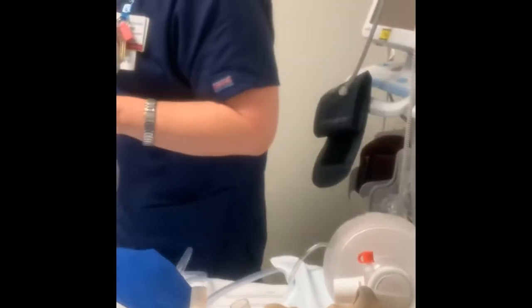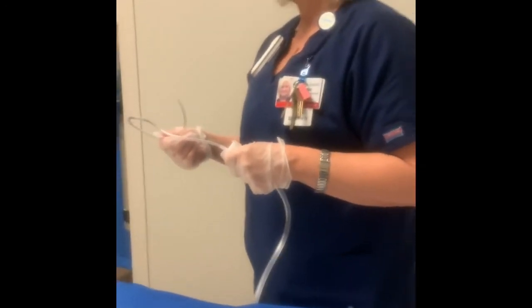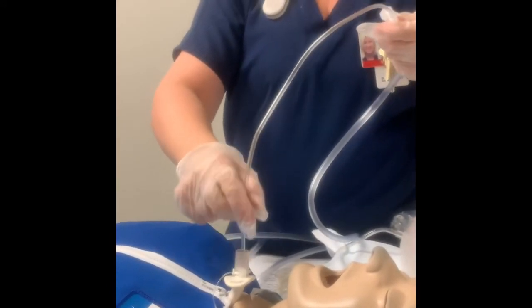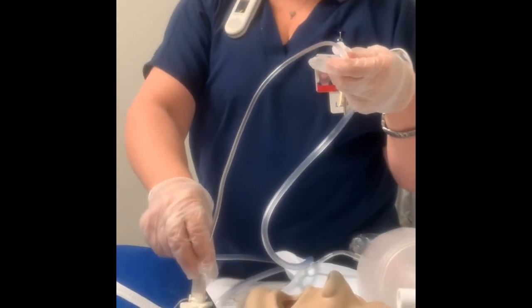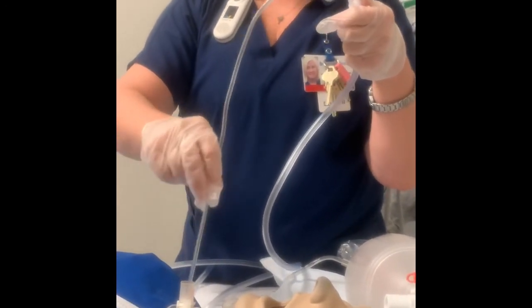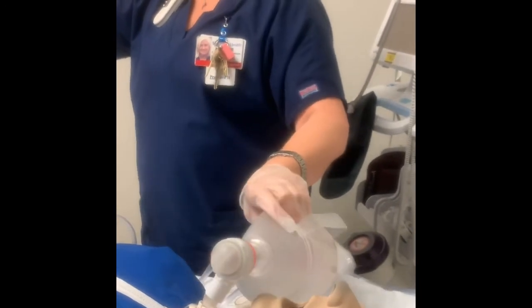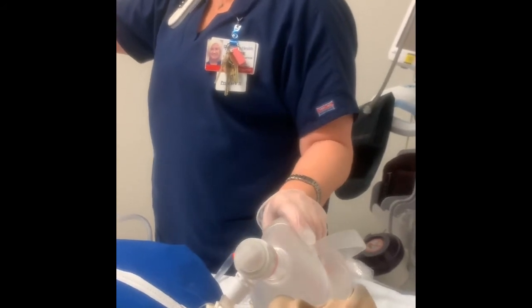15 seconds maximum, because otherwise you're going to desat them too much. Okay, so I'm going to ambu them with 100%, a couple of breaths. I'm going to go in gently. I feel my resistance come back a smidgen, put my finger on the suction, bring it up, slowly circle, come up, no more than what? 15 seconds. And then I can bring this over, and you kind of want to hold this over here and give them a little bit of oxygen, because they're going to have air hunger. They're literally going to suction all their air out.